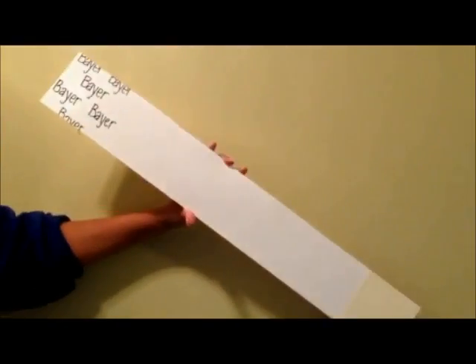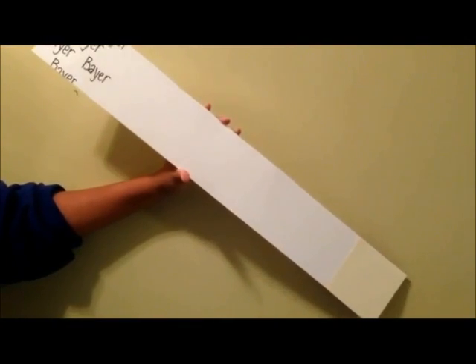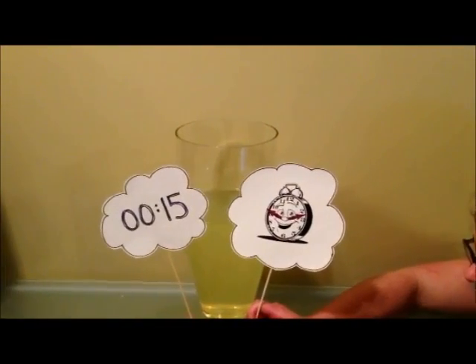Remove one strip from the bottle and replace the cap tightly. Be sure to do this so that you do not contaminate the test strips and to keep the test strips dry. Dip the end of the test strip into the urine sample. Now you want to remove the test strip from the urine, but be sure to do this by sliding the strip on the rim of the container to remove the excess urine. Wait exactly 15 seconds.